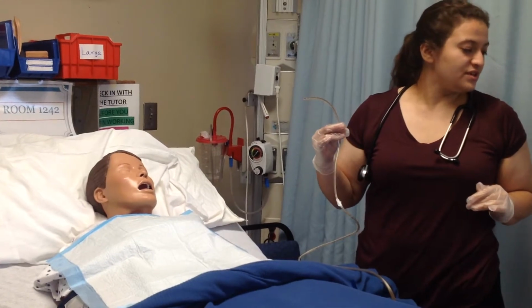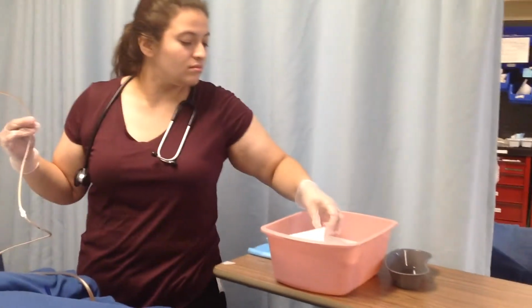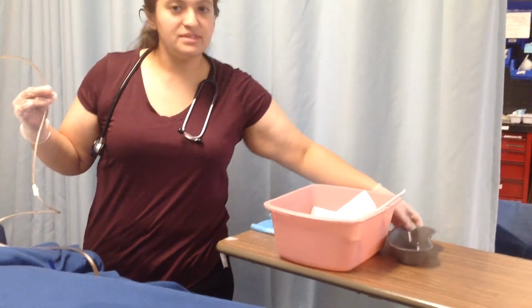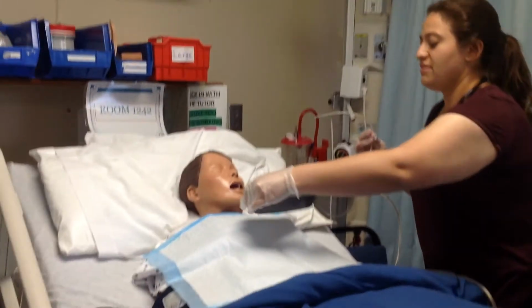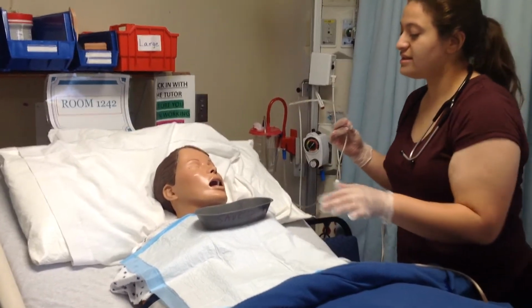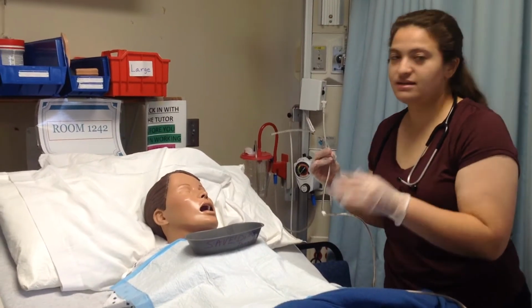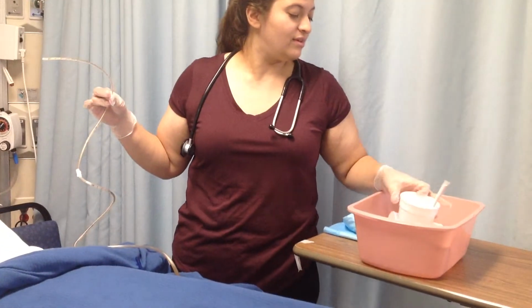And then first things first, I would make sure to get my emesis basin, and I would have the patient hold it. So sir, just go ahead and hold that. That's going to help you if you feel like you're going to vomit or if you feel like you might need to spit. So just keep that with you.